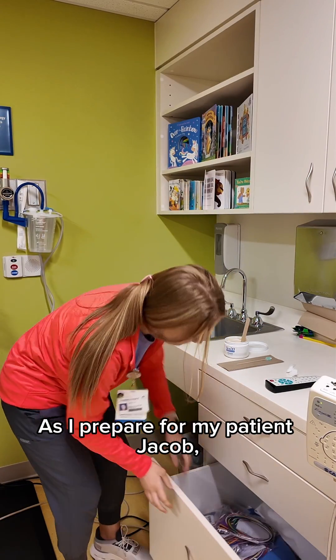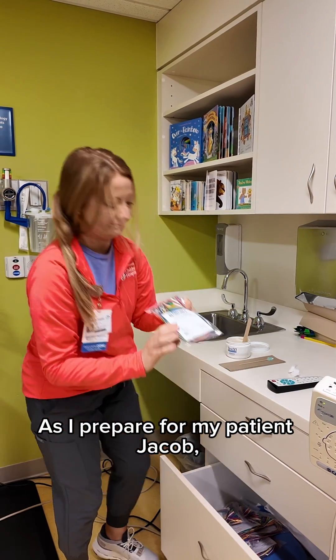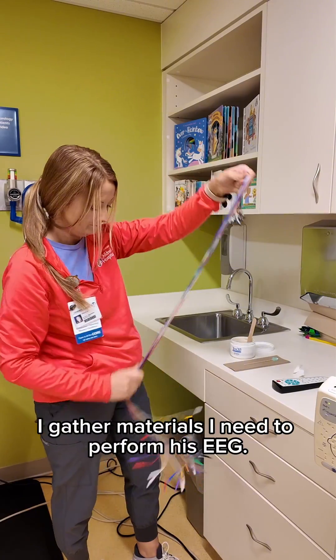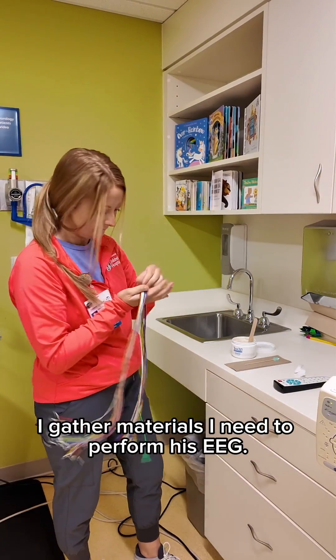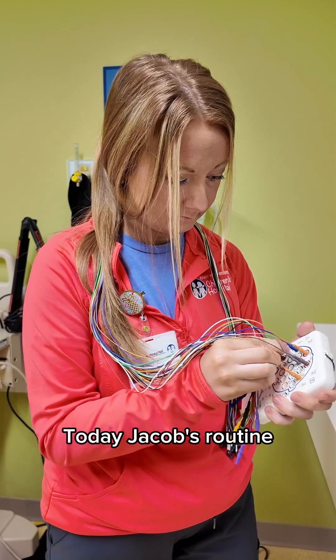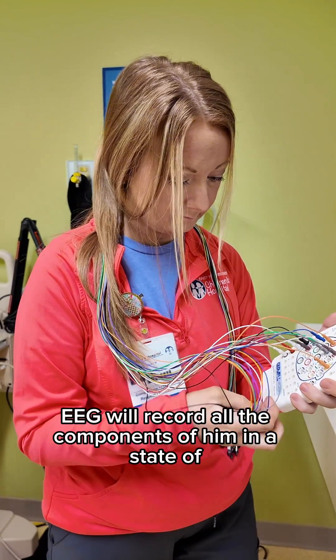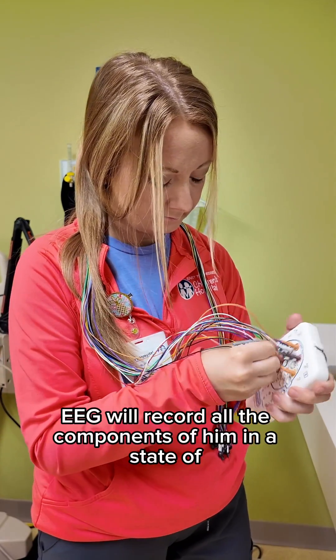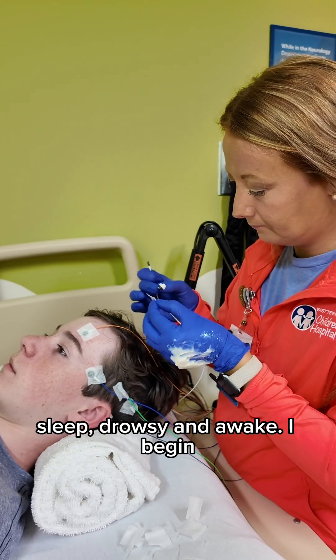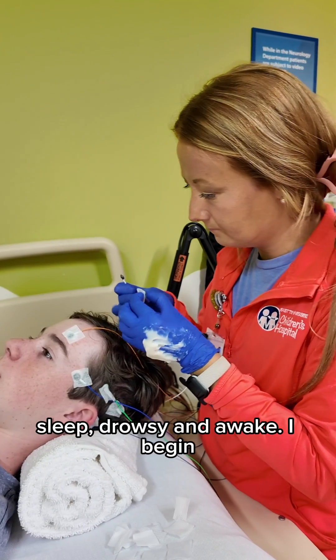As I prepare for my patient Jacob, I gather the materials I need to perform his EEG. Today, Jacob's routine EEG will record all the components of him in a state of sleep, drowsy, and awake.